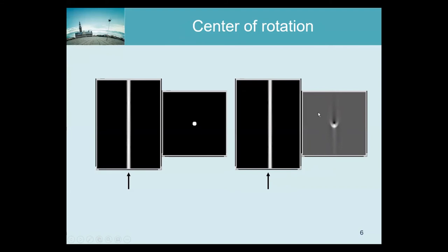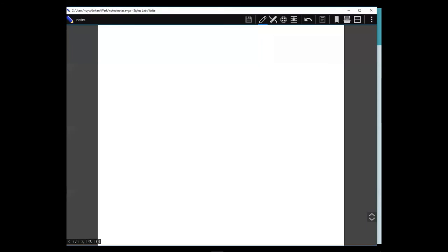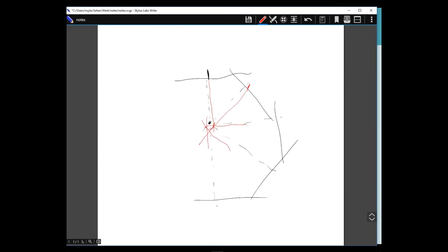And so what basically happens is, well, if you draw it, I'll try to draw it, the center is here. So ideally we should have this. Now suppose that there's a small offset with the electronics and the thing is projected here, but the reconstruction software doesn't know it. So you will get the back projection line here. And you will also get the back projection line in here, and here, and here, and here. And so this line, tangent to all these back projection lines, would see a lot of activity.